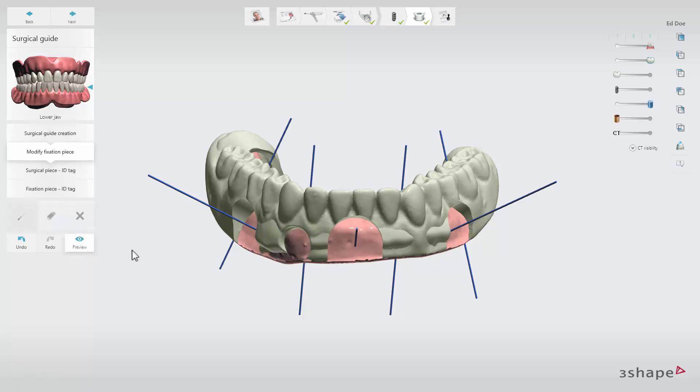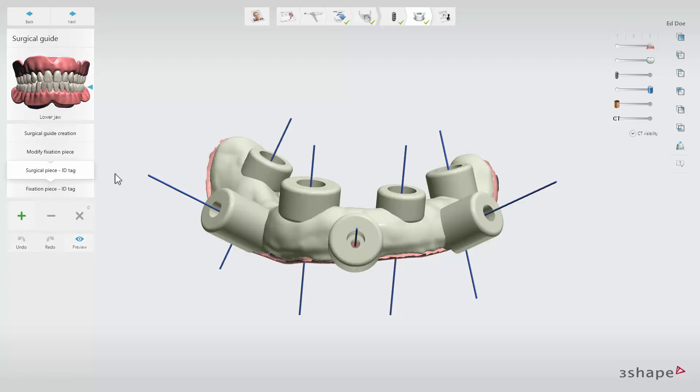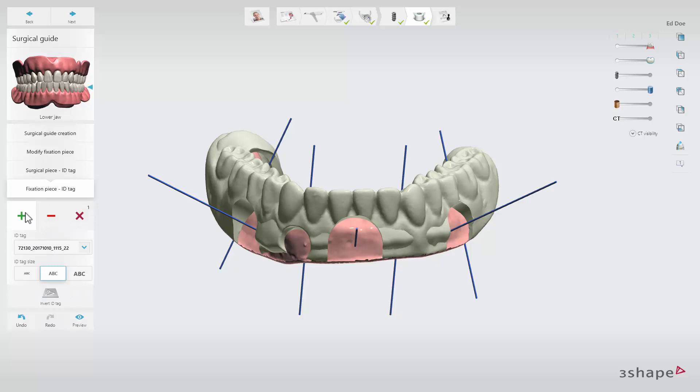On the ID Tag sub-step, you can add ID tags to both surgical guide pieces. You can change the default ID tag by typing in the ID Tag Text field. Move the mouse cursor over the guide and move the ID tag to where you wish to place it, then left-click the guide to place the ID tag. You can adjust the size of the tag or add more tags if needed.